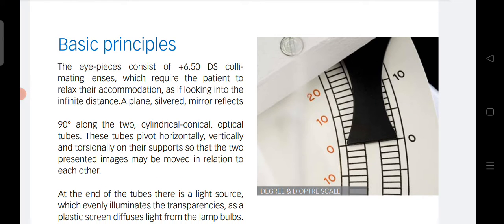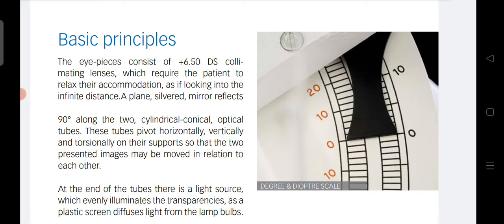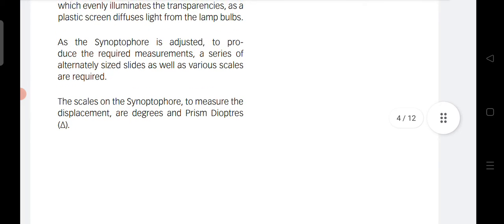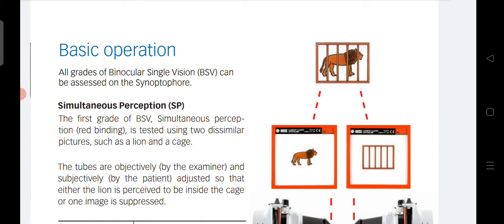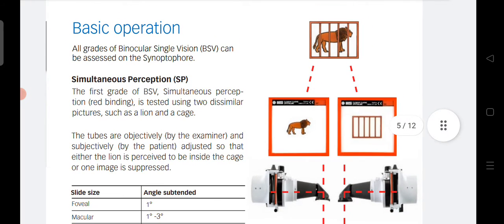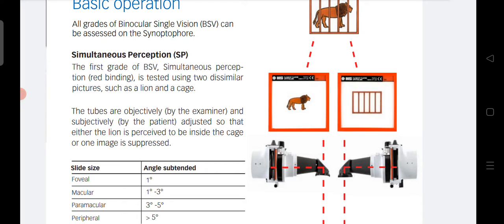Specifically, the eyepieces consist of plus 6.5 diopter collimating lenses. The first grade of binocular vision is SMP — simultaneous macular perception — meaning that two different targets are stimulated onto the retina of both eyes simultaneously; we are seeing two different images with both eyes at the same time.